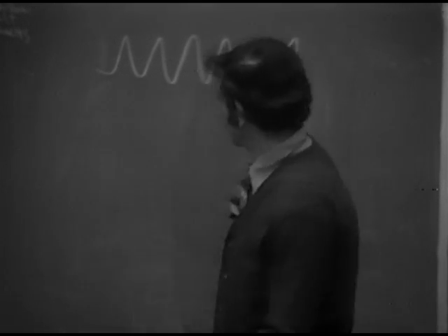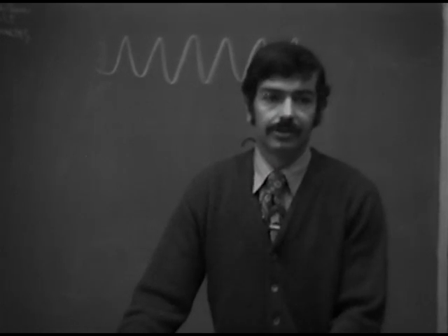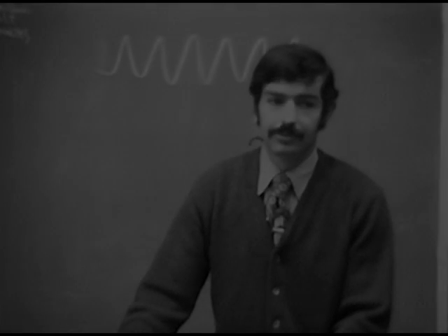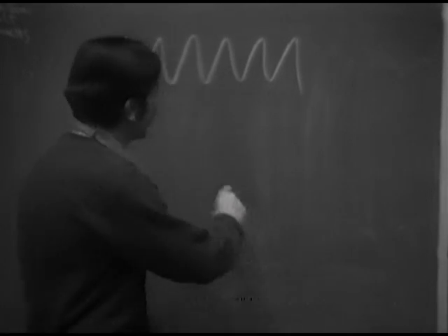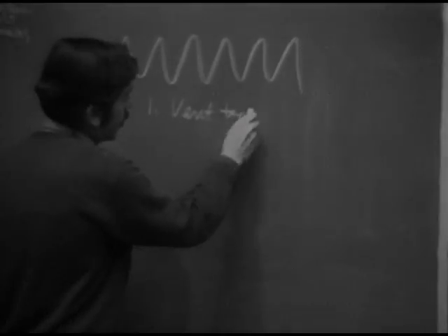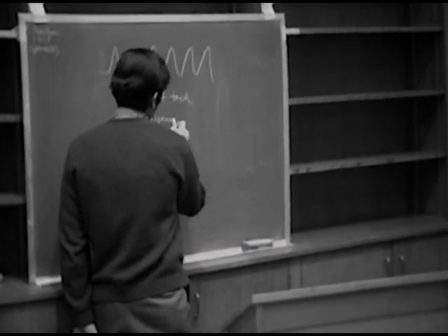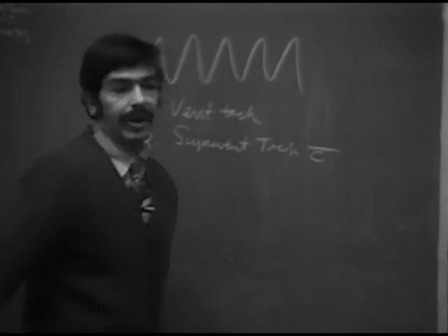Now, when we all look at this, we might right away think that this looks very much like ventricular tachycardia. But that's the question. Is it really ventricular tachycardia? What else might it be? It may not necessarily be ventricular tachycardia. One possibility certainly is ventricular tach, but another one is supraventricular tachycardia with a wide QRS complex.